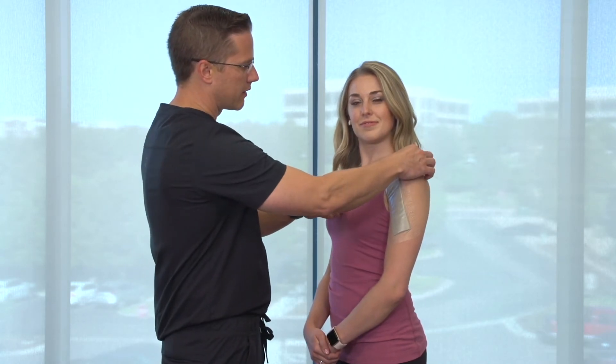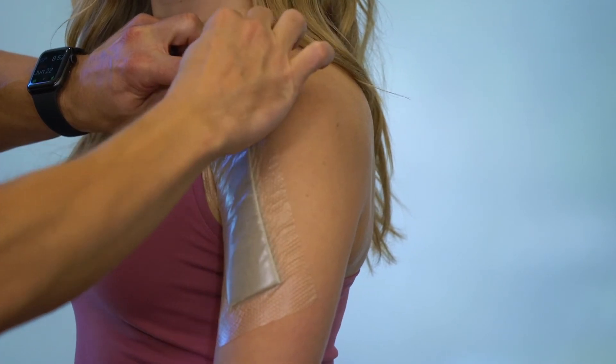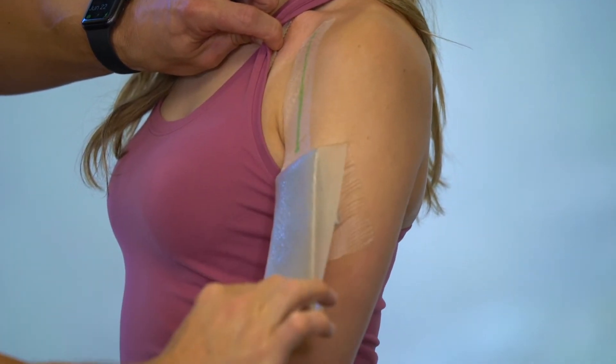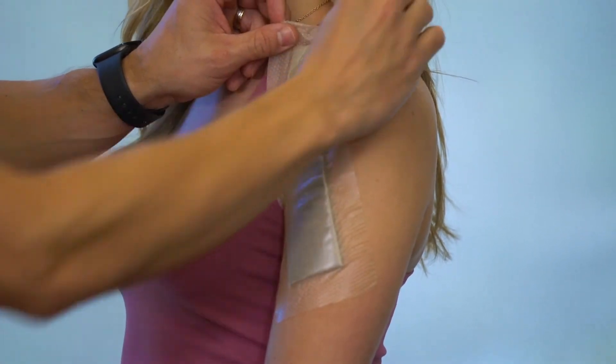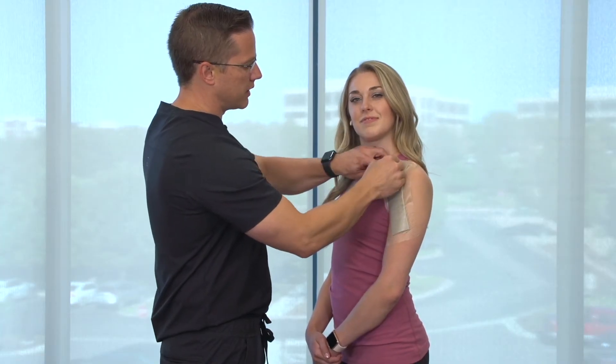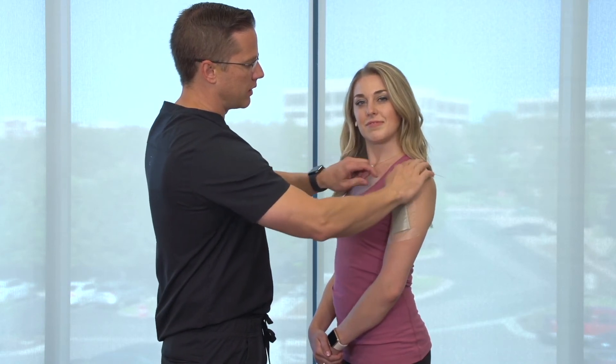Usually the dressing stays on until your first post-operative appointment. But if you had to peel back the dressing, you can actually peel it back to look at the incision and then put it right back on. This adhesive can stay stuck down. We usually recommend that you keep this dressing on until your first post-operative appointment.